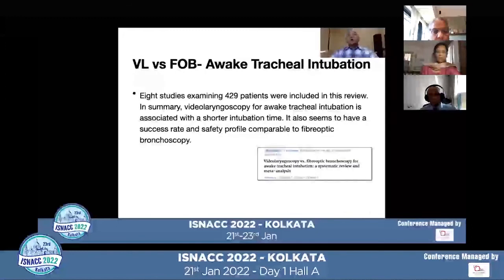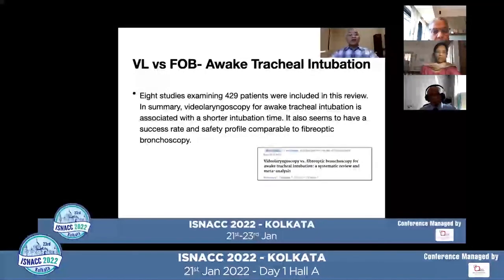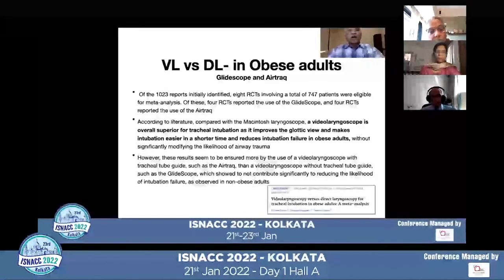For awake tracheal intubations, 8 studies including 429 patients were included. Video laryngoscopy for awake tracheal intubation is associated with shorter intubation time. It seems to have a success rate and safety profile comparable to fiber optic bronchoscopy. In obese patients, 1023 reports were initially identified and 8 RCTs involving 747 patients were eligible. Video laryngoscopy was overall superior for tracheal intubation as it improves glottic view, makes intubation easier, shortens intubation time and reduces intubation failure in obese patients.